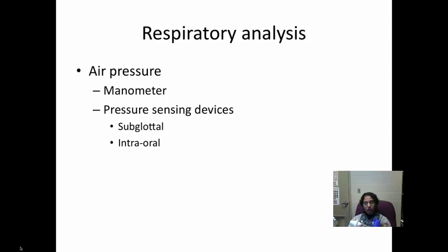Now, I always like to tell the story, and it's interesting because, as part of being a researcher, as part of being a person that likes to understand things, we had a research experiment where my advisor, Kiri Verdellini, wanted to measure the subglottic pressure during different phonation tasks. So we wanted to measure at low volume, at normal volume, and at high volume, 3 different loudness levels, on a single sound, the ah.